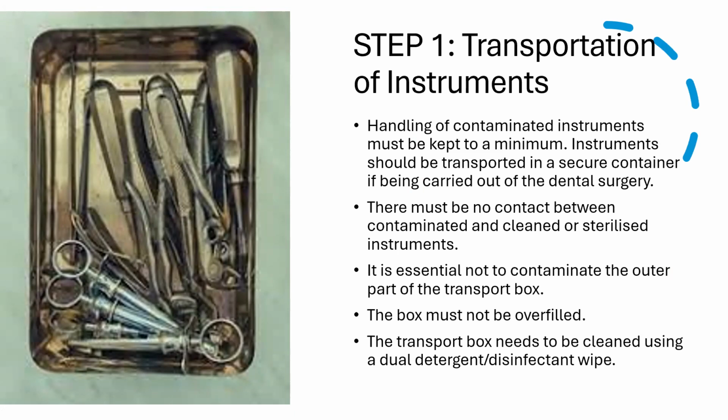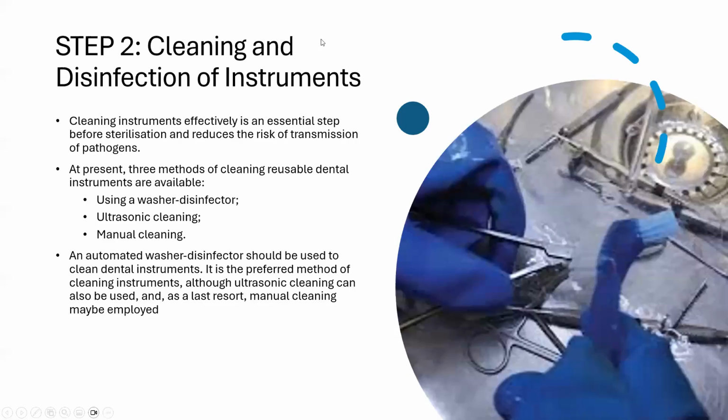There must be no contact between contaminated and cleaned or sterilized instruments. It is essential not to contaminate the outer part of the transport box. The box must not be overfilled. The transport box needs to be cleaned using a dual detergent or disinfectant wipe.